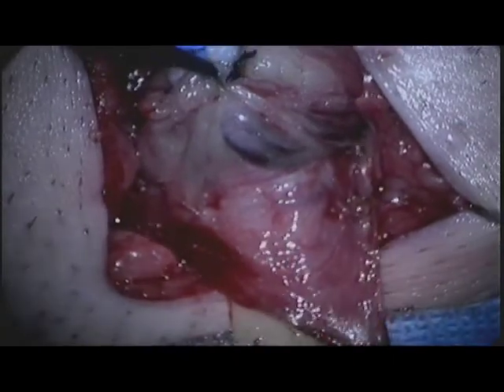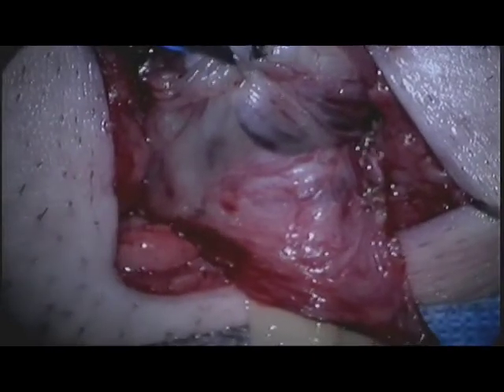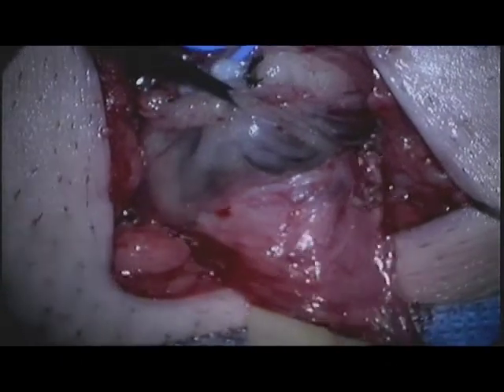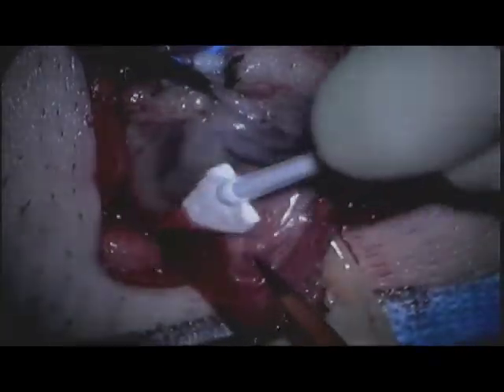Bipolar electrocautery is used to transect the non-vascular appearing tissue. When venous structures are identified, these are tied off with either 3-0 or 4-0 silk suture.